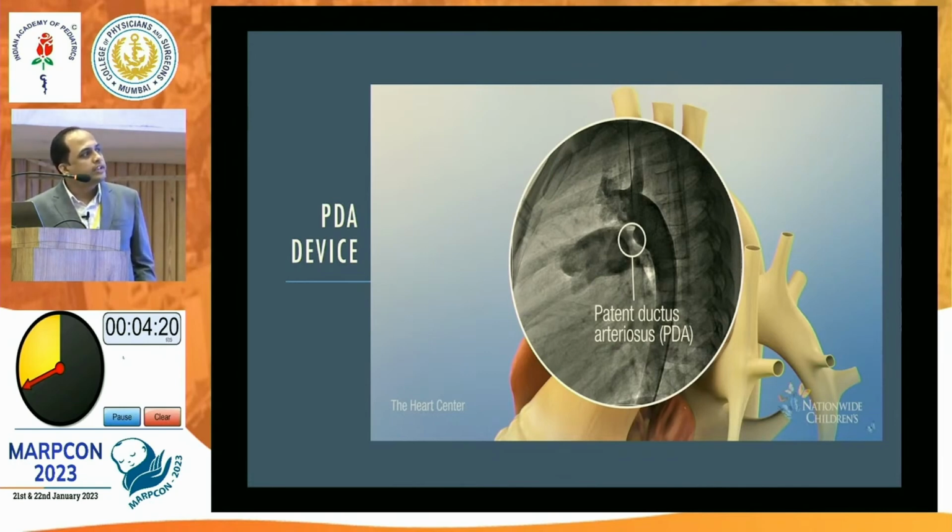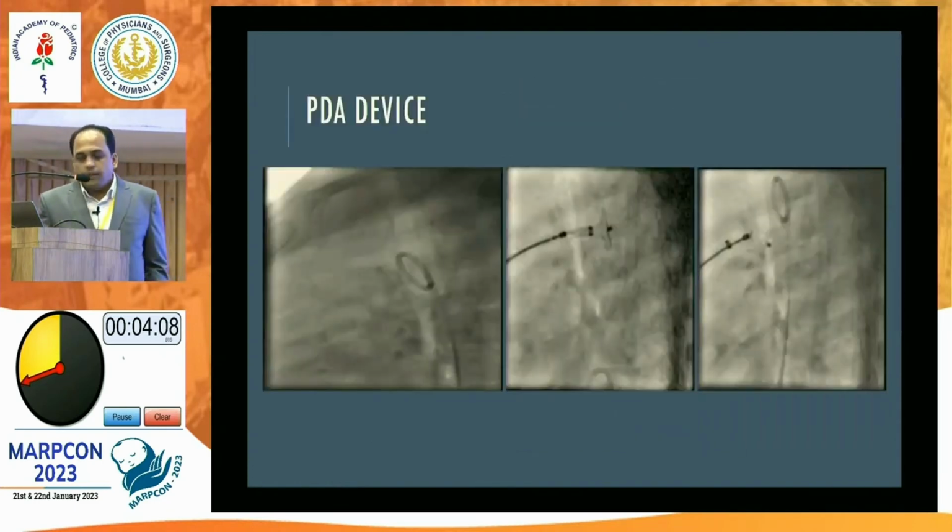And now you can see this is the pulmonary artery. You can even see the pulmonary wall here. Because of this connection you can see the pulmonary artery. It means there is a shunt: you are injecting in the aorta and seeing this, so flow is from the aorta to the pulmonary artery. So why do we need angiography? Just to see the defect size.